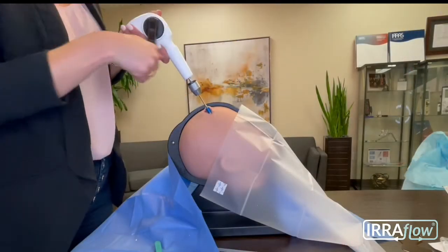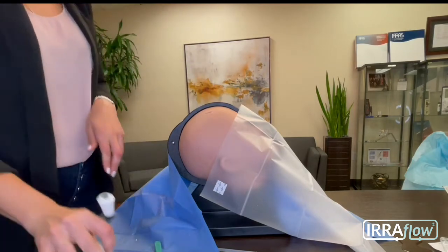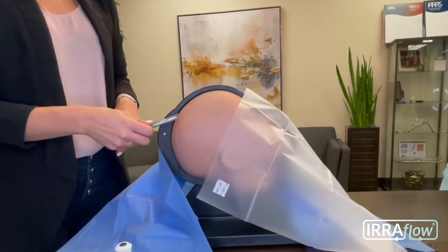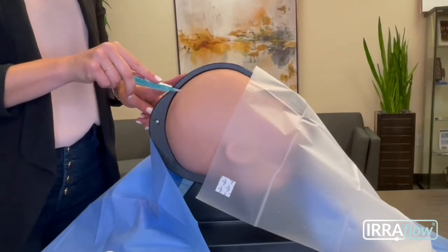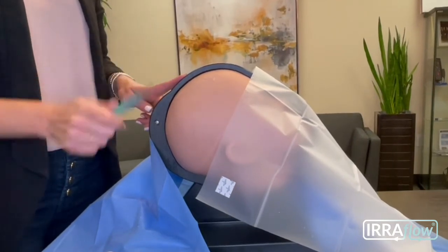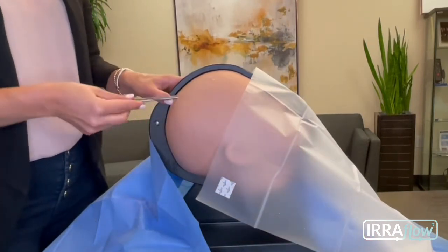Once you've found your access point, you'll want to drill your twist drill hole, ensuring that you're staying in line with your trajectory. Next, you're going to measure about 5 centimeters posterior to your cranial access point, using a scalpel to make an incision down to the bone. Prior to inserting the IRRAflow catheter, it's critical to ensure the dura has been fully incised.